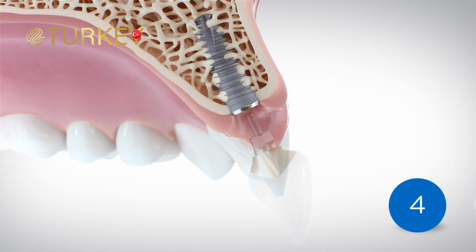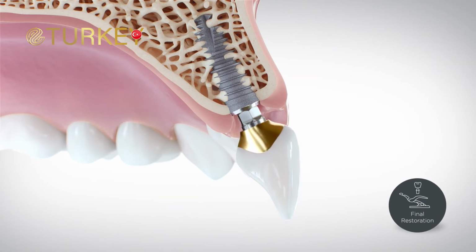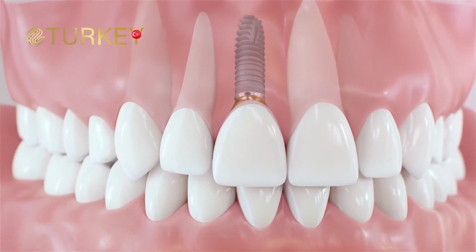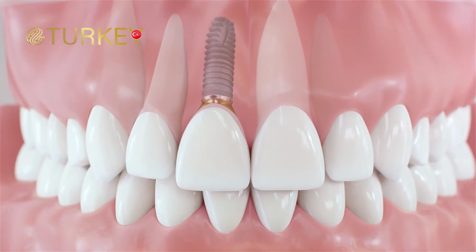Once healing is complete, the temporary abutment is replaced with a permanent one during Step 4. Your new tooth is now in place, feeling and functioning like a natural tooth.